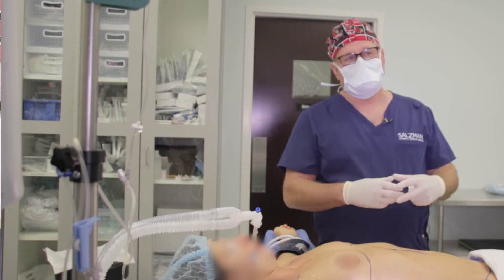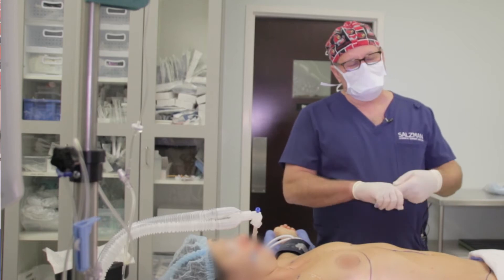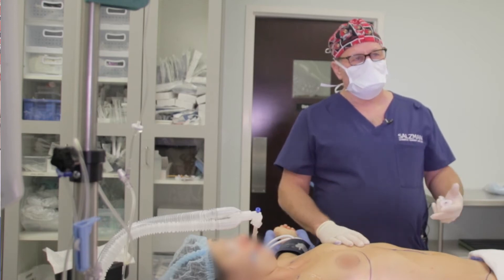We give a little test dose, we see that anechoic spread between those two muscles, and then the nurses change the syringe and we put 30 cc's per side of a mixture of Exparel and saline.